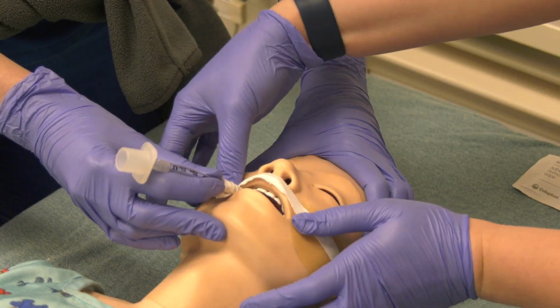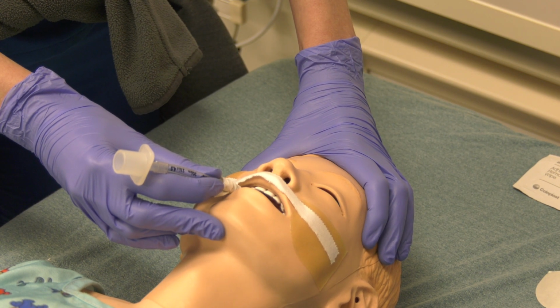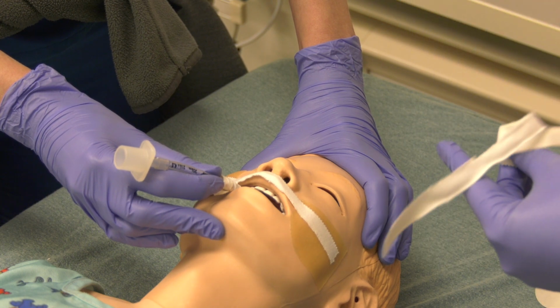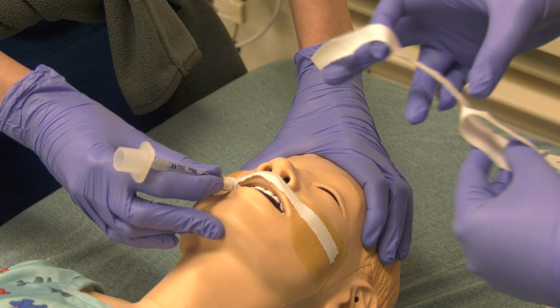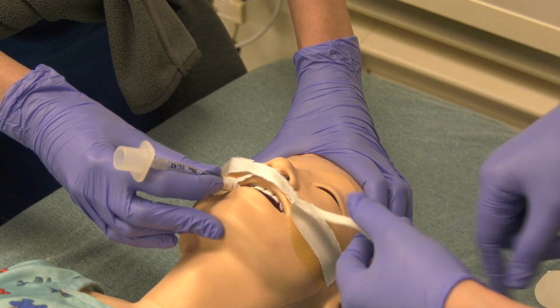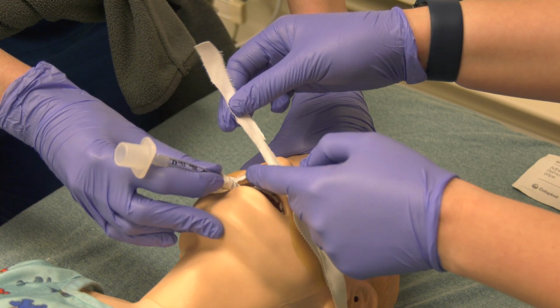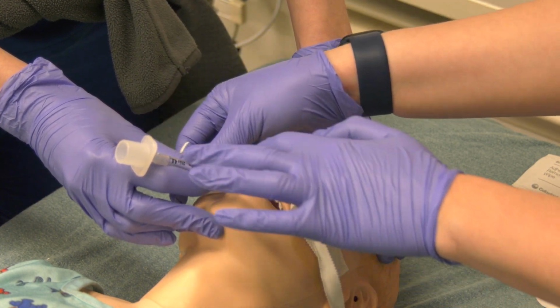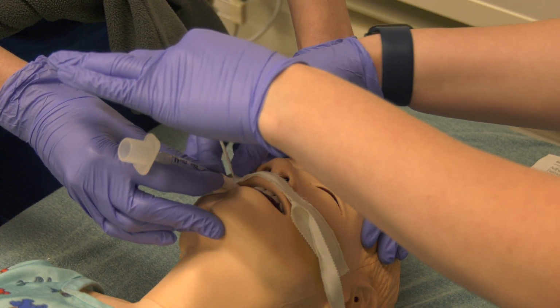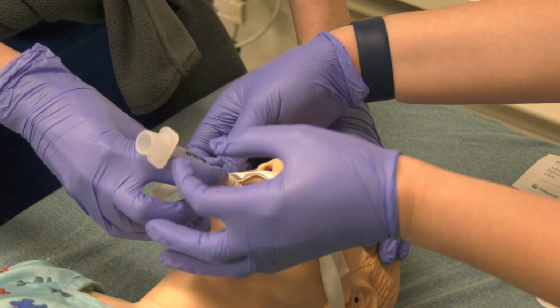Ensure that that is completely adhered. And then I will start on the opposite side. Get as close to the mouth as possible. Make sure that it's not on the patient's mouth if you can avoid it, on their lip.